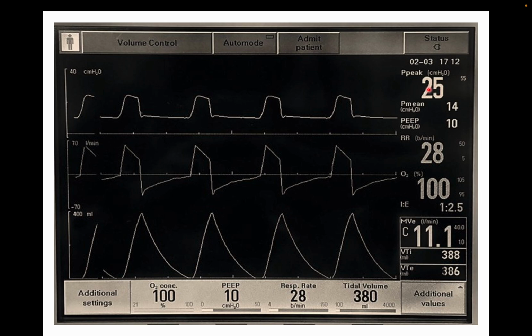So we did discuss P peak. P peak is the peak pressure attained during the pressure delivery. If the P peak is more than around 35 to 40, it suggests kinking of the tube, upper airway obstruction, tube blockade, or bronchoconstriction. If the upper airways are blocked, that can be due to kinking, tracheal obstruction, or a mucus plug blocking the ET tube. That will increase the P peak.